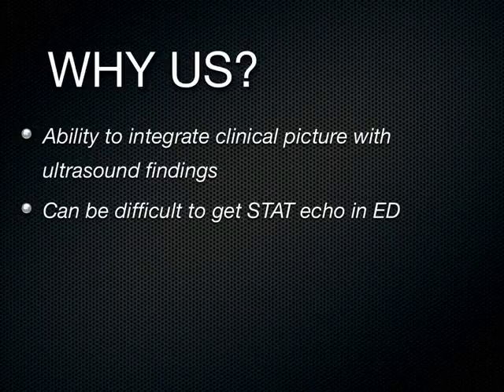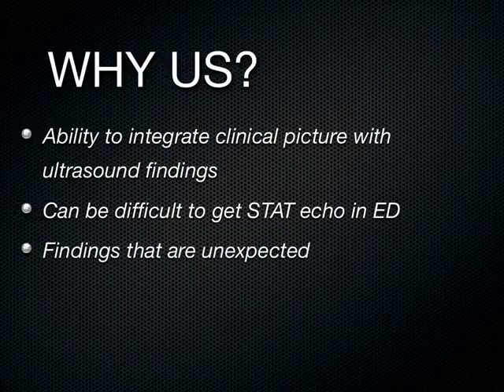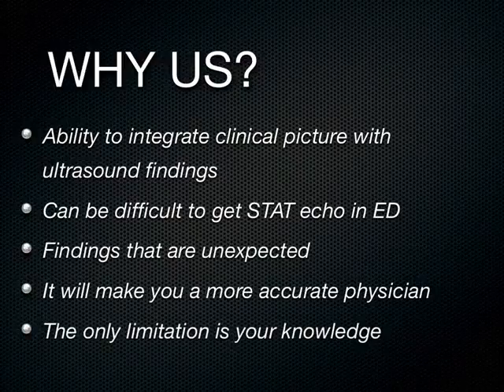We know sometimes it's difficult to get cardiology to come down and do a stat echo depending on the time of day. And by stat, maybe it gets done in 15 minutes, maybe 20 minutes. I don't know. Stat for me means in the next 60 seconds. And also, like in that patient, it was an unexpected finding that we had. And I think all that makes you a more accurate physician, the only limitation being your knowledge.